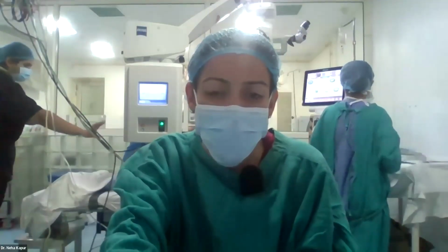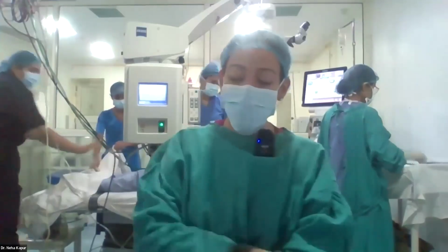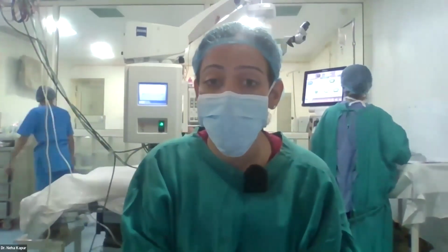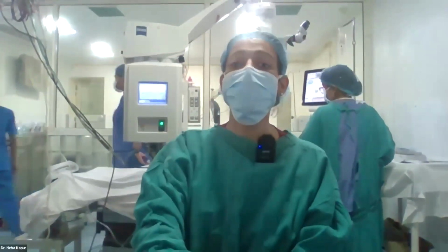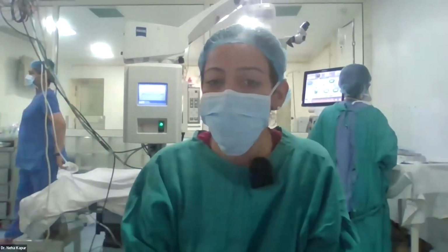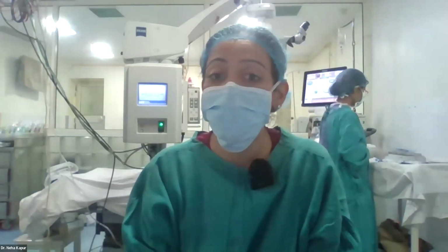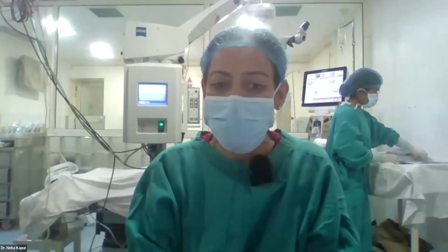Can this patient experience improved refractive error? Well, definitely the patient should do well because I'm assuming the cataract surgeon would have put the IOL with respect to a virgin cornea. The only thing is that now we do expect, because of the hyperopia, there may be a small hyperopic refractive error that the patient develops post-op, but that will take about 6 weeks to completely define.